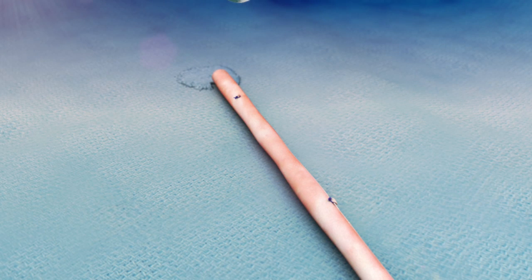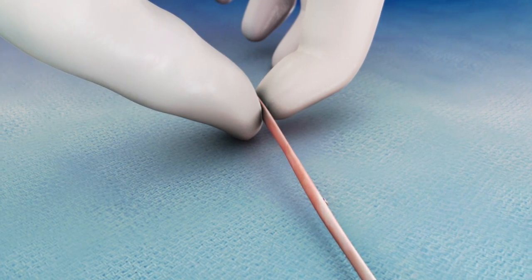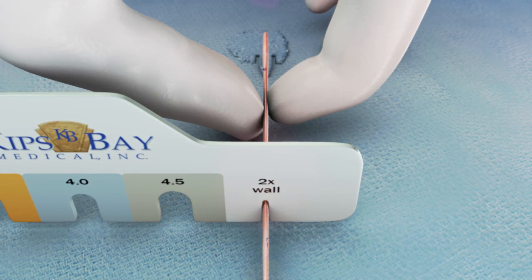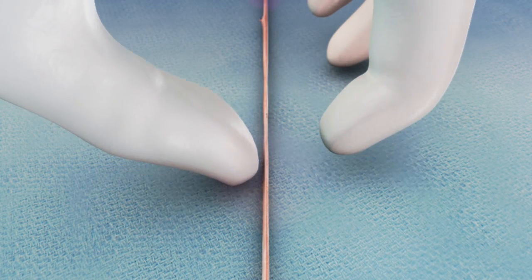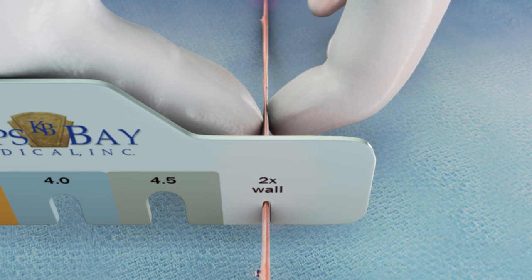The first step in qualifying the vein for use with the mesh is to assess its double wall thickness. This is performed using the sterile sizing tool supplied with each device. The decompressed vein should fit into the 2x wall slot on the sizing tool as shown, without deformation or stretch. Be sure to assess several locations along the length of the vein. If the vein does not easily fit inside this slot without deformation, then the ESVS mesh should not be used.